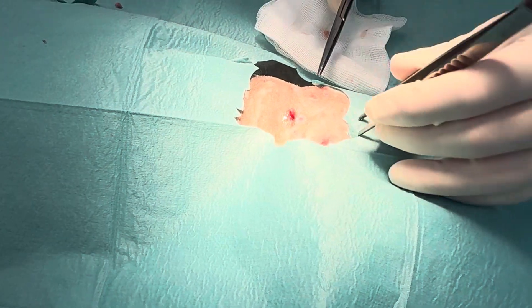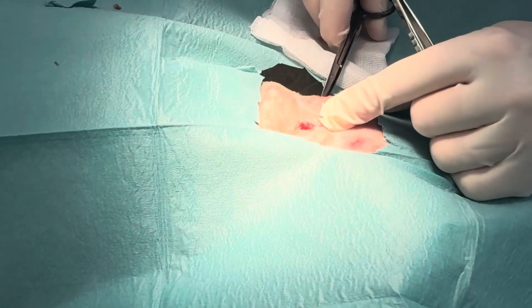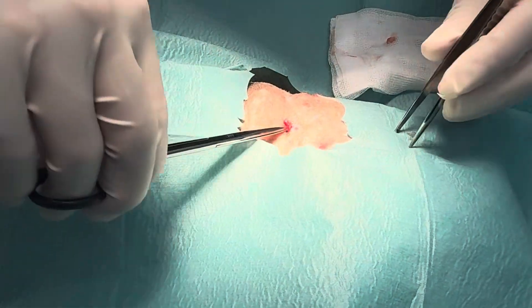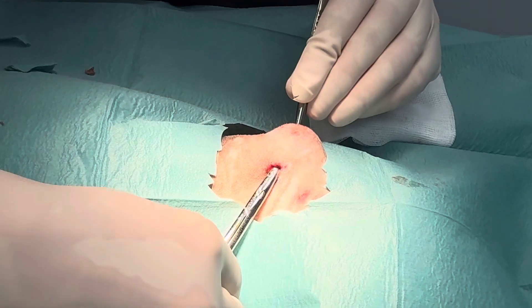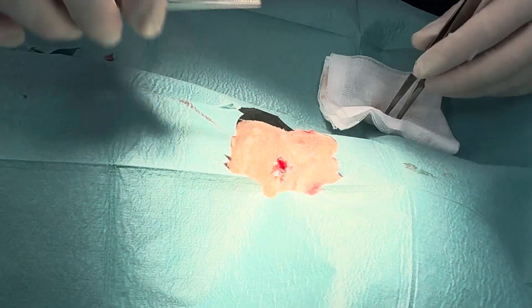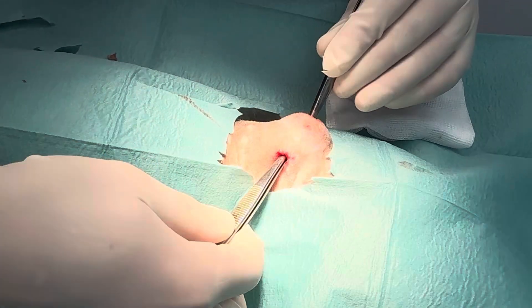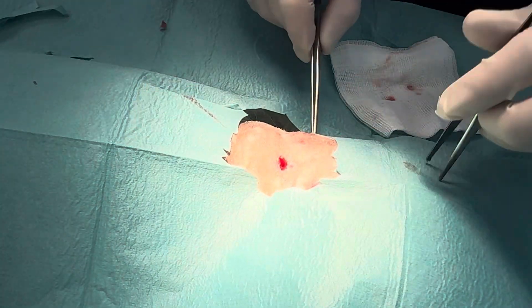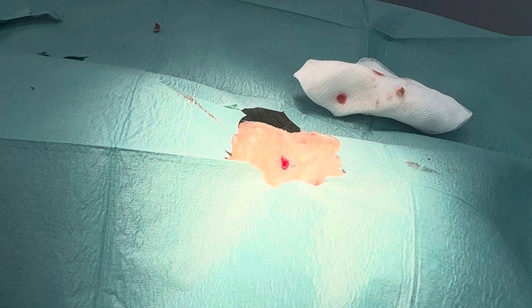The point of the drain is to help with the drainage of the fluid and the build-up underneath. You want to try and get it to go from one side to the other — sometimes very difficult. This is going all the way through. In an ideal placement, it goes from the deepest part of the pocket to the other deepest part. So we've got some sterile flush all set up.